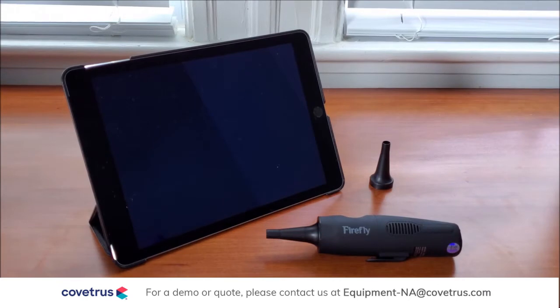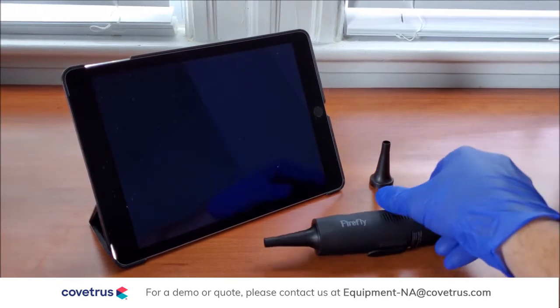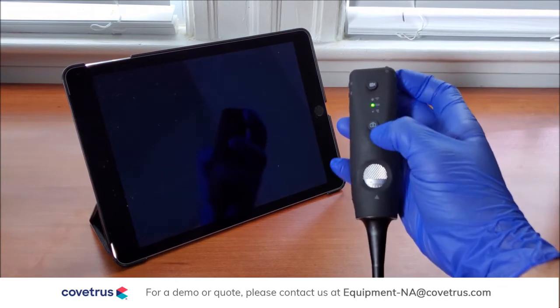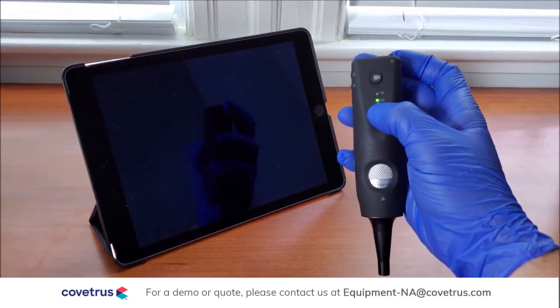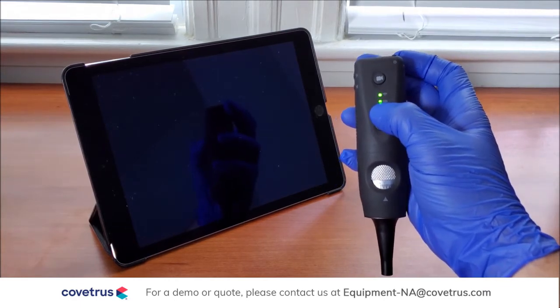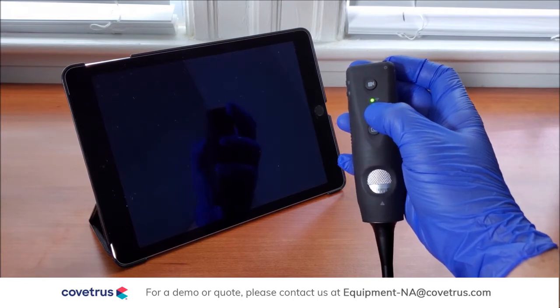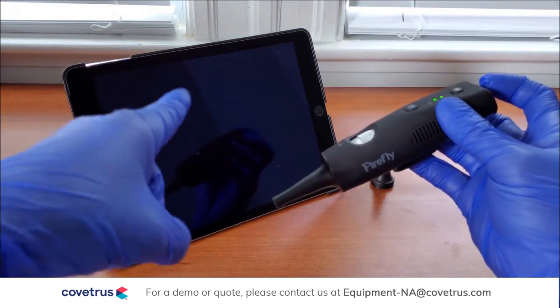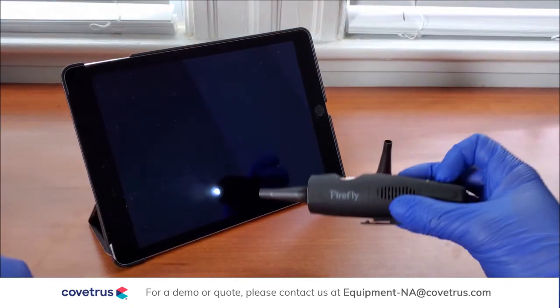To connect your otoscope to your tablet or phone, first press the button on the back of the otoscope to turn it on. This will illuminate the battery light — green means the battery is full. A second light will turn on; this is the wireless signal. When this turns on, the otoscope is transmitting a signal that can be connected to on your tablet or phone.